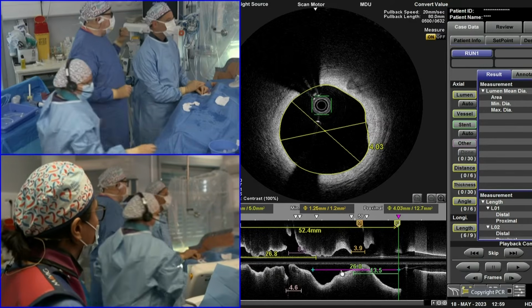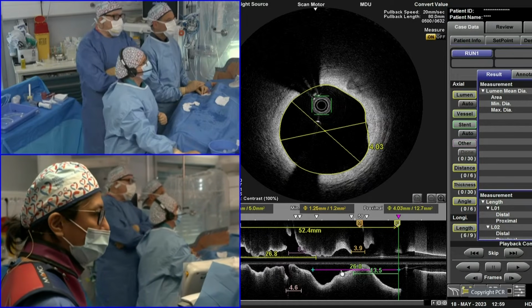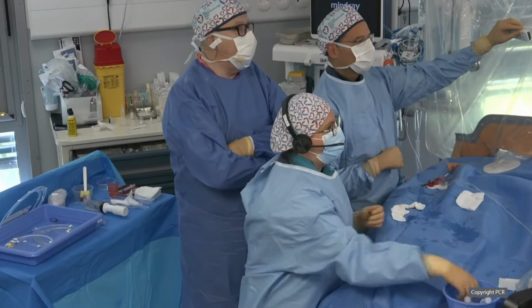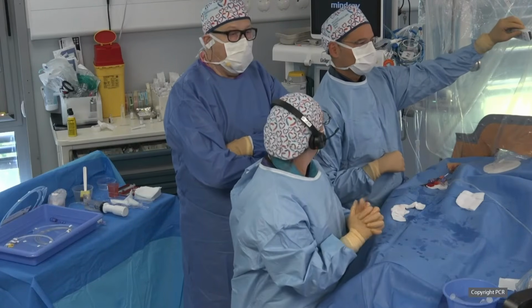Okay. Thank you very much. Thank you very much. You can show us the images of today, starting from the two angio images acquired today.